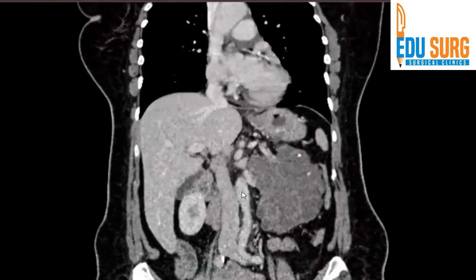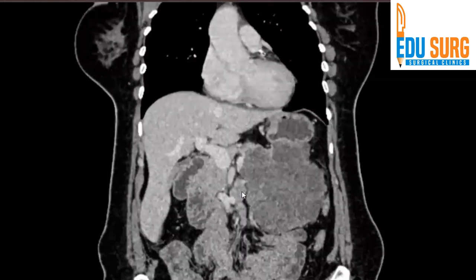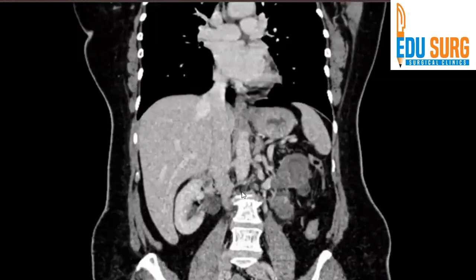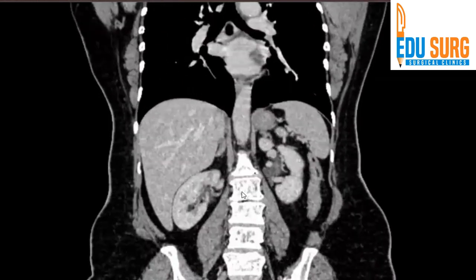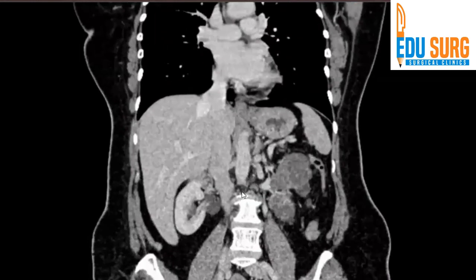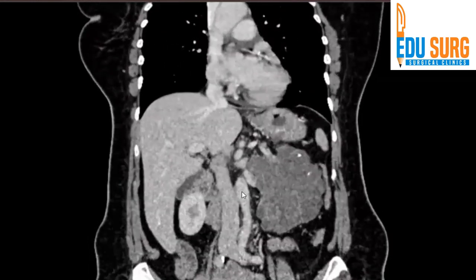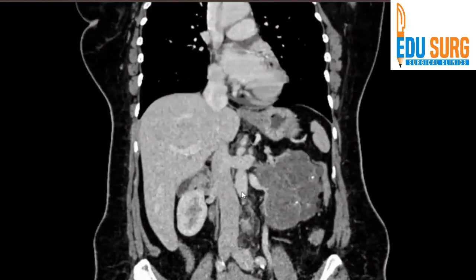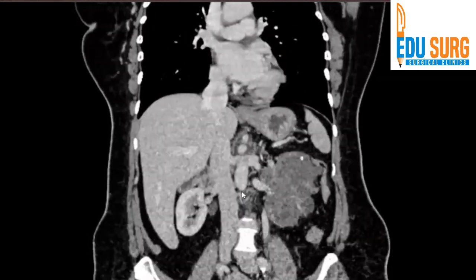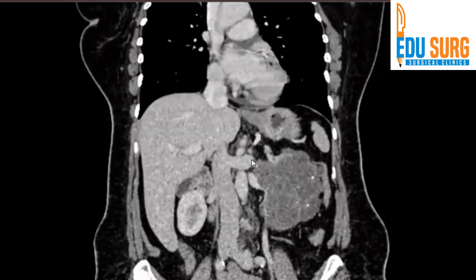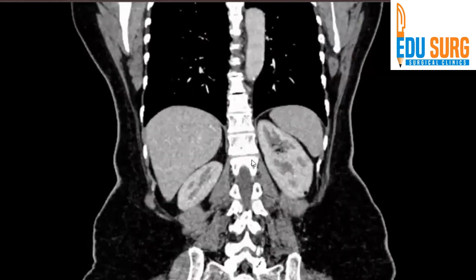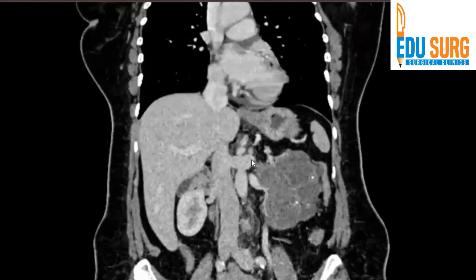It is very important to look at the coronal section. The important vessel to identify here again is the splenic vein and related structures. The splenic vein is cutting the tumor but is free. Another important structure to identify is the inferior mesenteric vein.